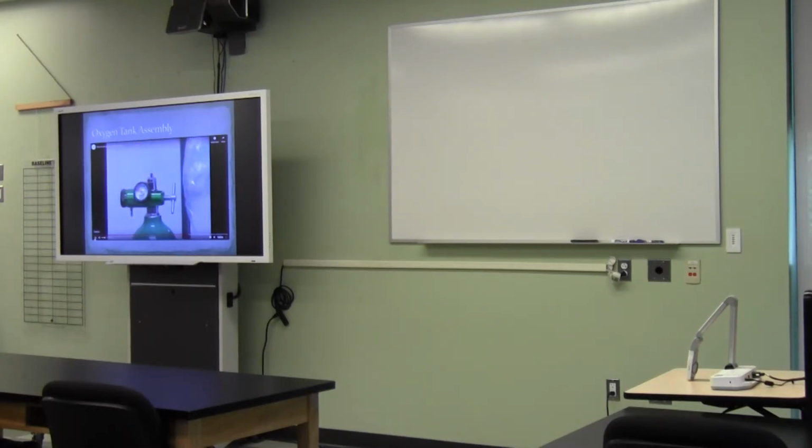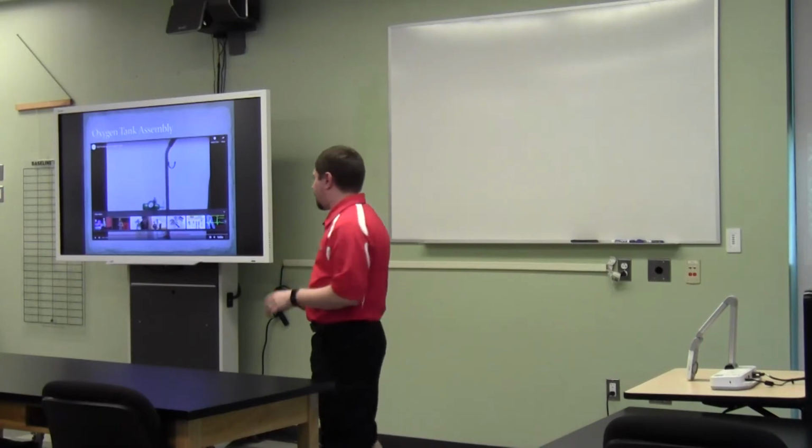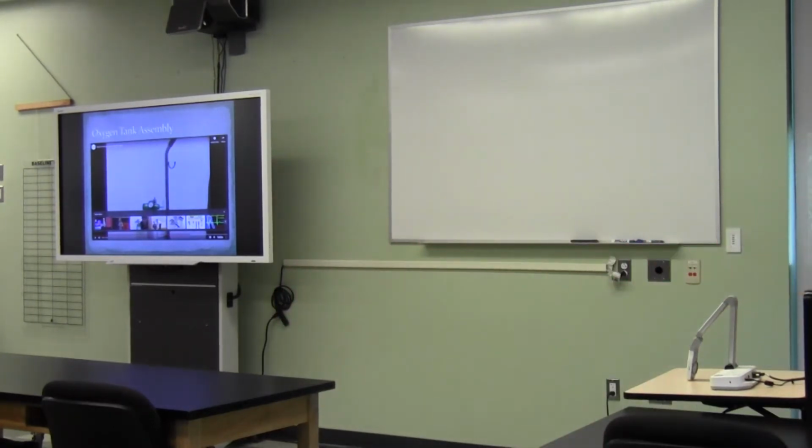Then on the bottom here, you're going to connect your tubing, which I'm going to end there because they end up showing how to connect oxygen delivery devices. We'll talk about that here in a little bit as well. Questions, concerns about that?